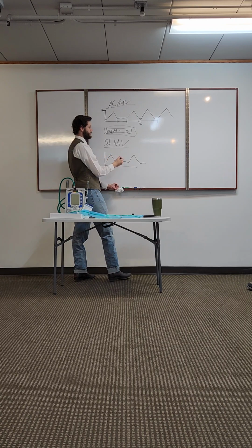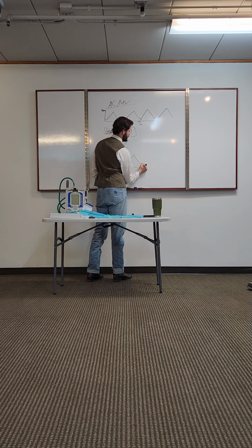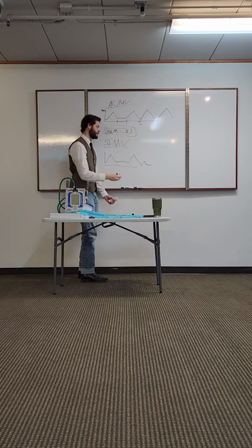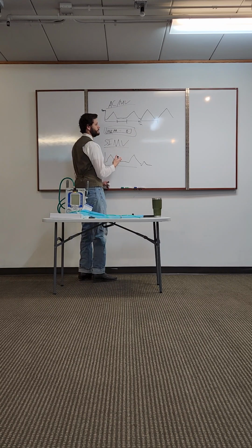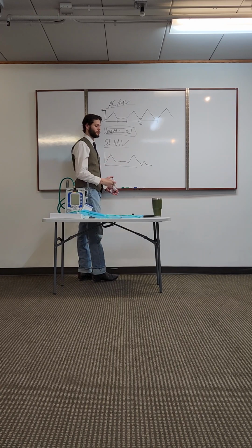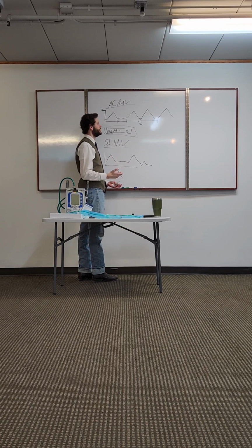Right, that's where SIMV comes in. If a patient tries to initiate a breath here in SIMV, the patient can do whatever they want to do with it. So they can have a small breath, they can have a big breath. Whatever the patient is capable of, as long as they hit that pressure trigger. That's the SIMV. But we're not going to use that so much, because most of what we're doing is people who are post-cardiac arrest, people who are in ARDS, severe illness states, where you want lung rest and recovery.